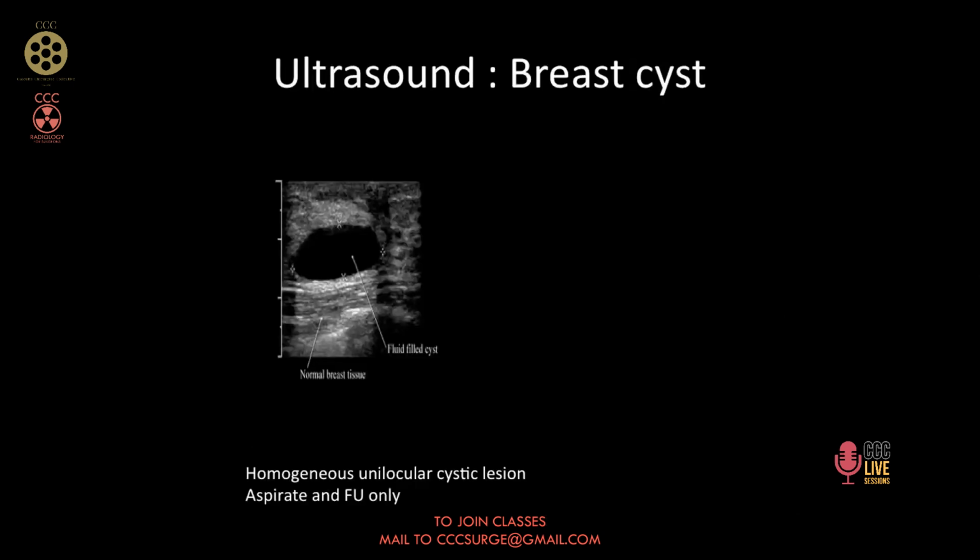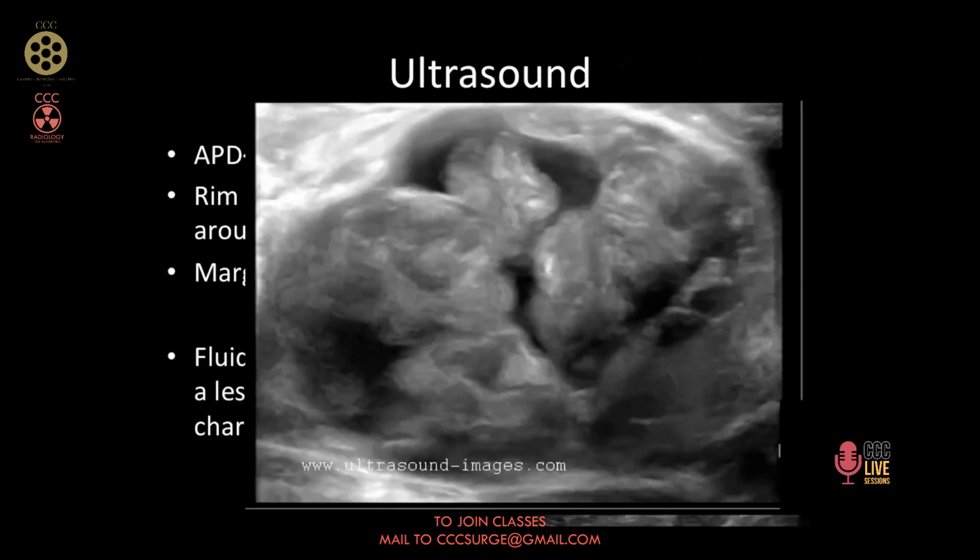We come to another, what is the difference? Sir, what is the difference between a cleft and a cystic space in a lesion? Oh, a cystic space is a bigger space. A cleft is just a conduit. A cystic space is, when you look at it, there may be an internal area of.